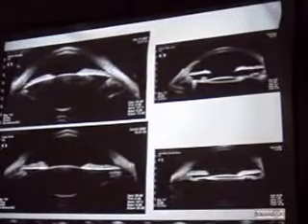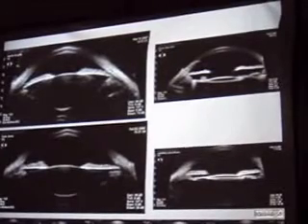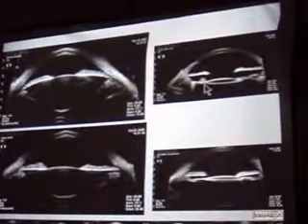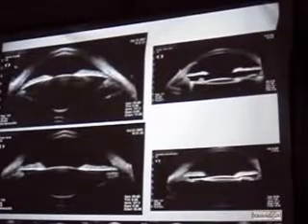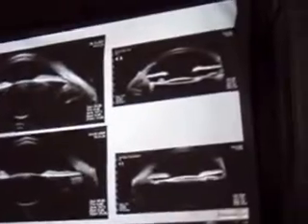As a simulation, or probably as a dream, I just put on the right 2 images of one of those intraocular lenses that you control in your slit lamp, where the lens is a millimeter away from the iris, from the pupil, and there are some other lenses that you see just contacting or almost occluding the pupil.